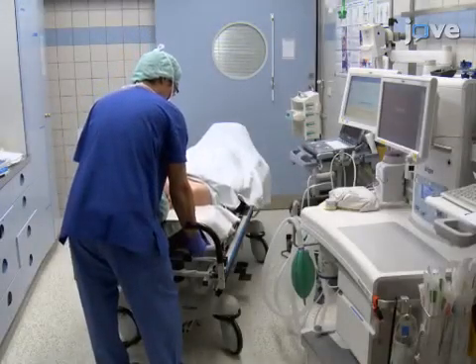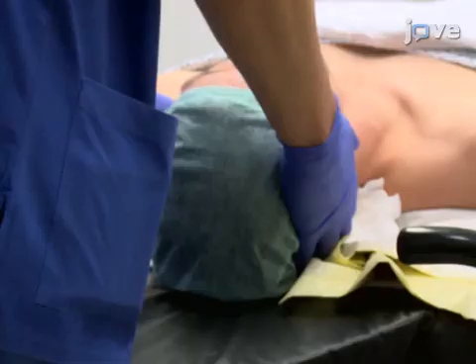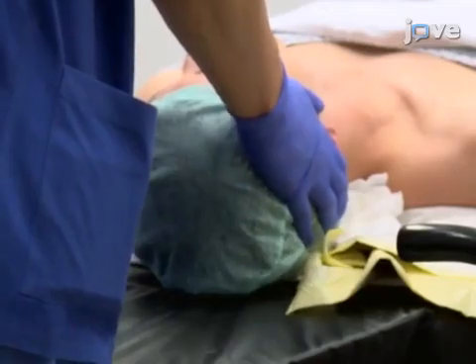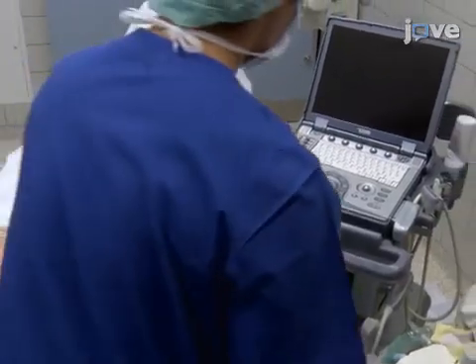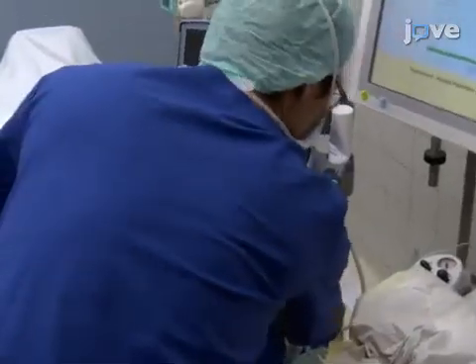Start by placing the patient in a supine position. If awake, the patient may have their head elevated for comfort. Then position the ultrasound machine so it is in line with the operator's position and the puncture site on the patient. The operator should be able to see everything at once.